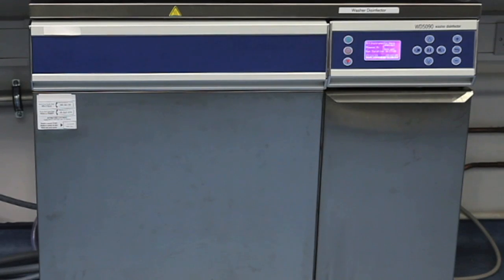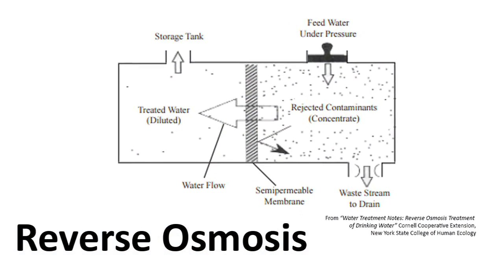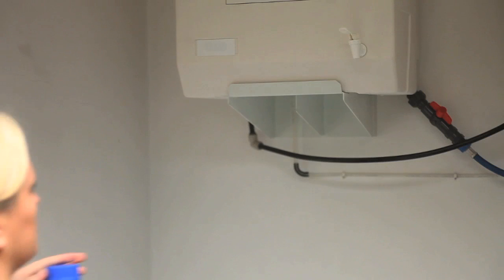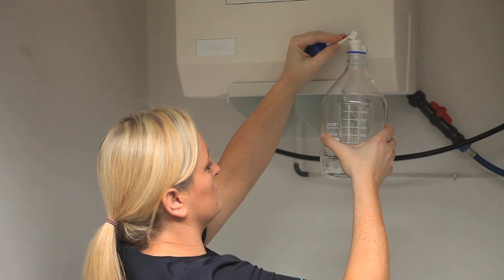The manufacturer's instructions will guide you to the type of water and cleaning agent to be used in the washer disinfector. The washer disinfector must have specially treated water supply, such as reverse osmosis generated water. Reverse osmosis, RO, is a technology that uses a semi-permeable membrane to purify water. It does this by removing large particles, including bacteria and many types of dissolved molecules and ions, from the water supply. The purified RO water is collected and can be used directly or stored for future use.